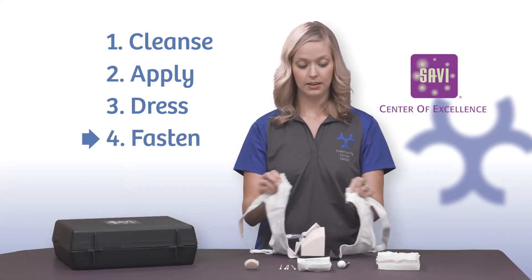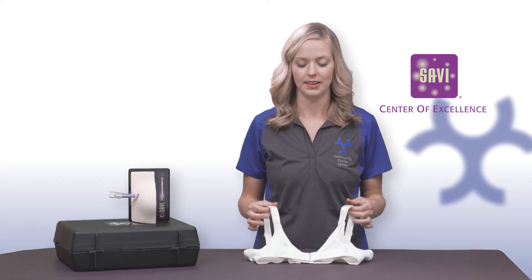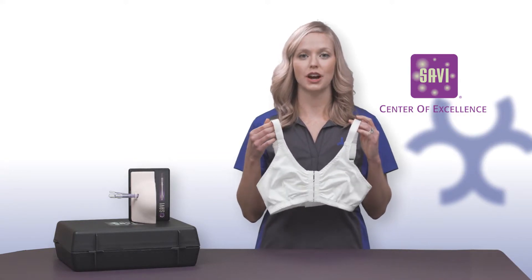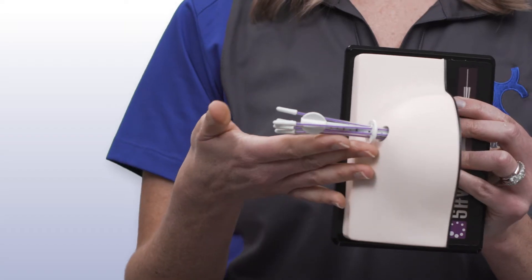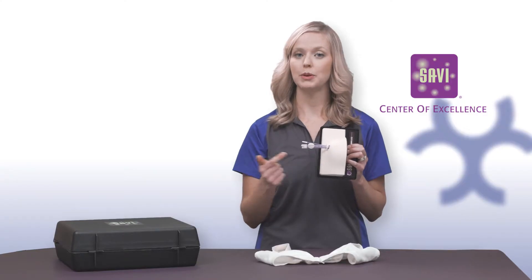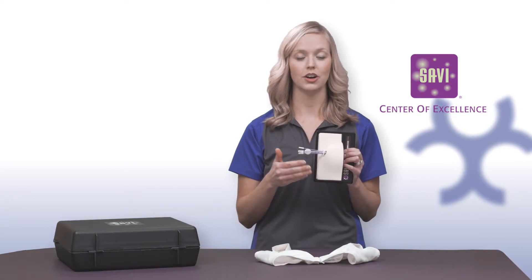Fasten. Fasten the bra. Here are some bra fastening tips. In your kit we've included a front fastening bra. We have found that this is the most comfortable for patients during treatment. It's always best to keep your catheters as straight as possible. During treatment, radiation will be running through each one of these tubes. Any kinking or damage can compromise your care.